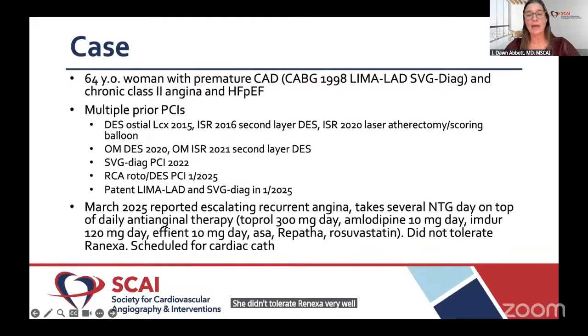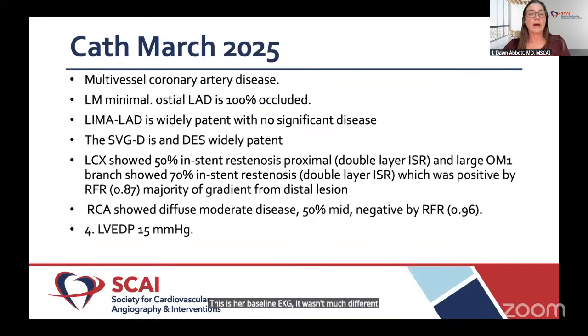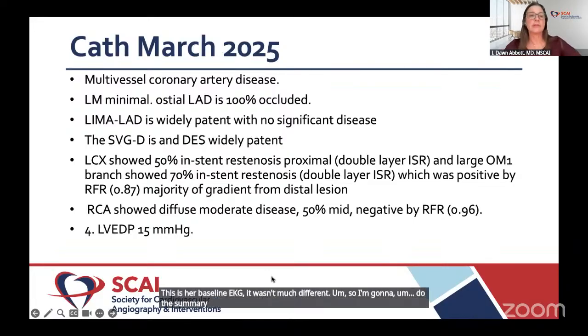She's on Effient, Repatha, etc. Everything you can think of. So we brought her back in for an angiogram. This is her baseline EKG. It wasn't much different. So I'm going to do the summary and then show you some selected images.